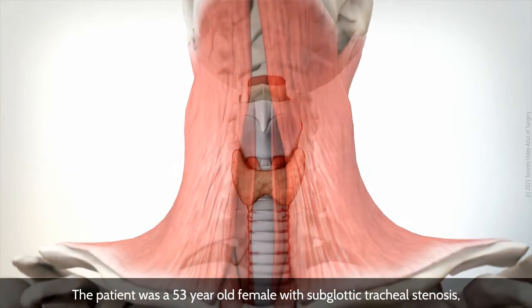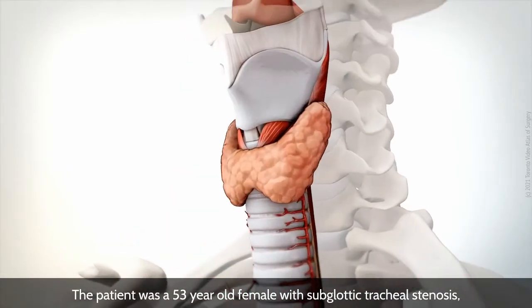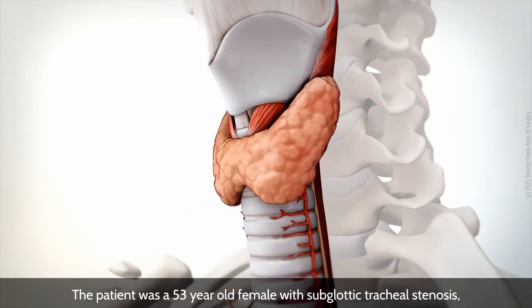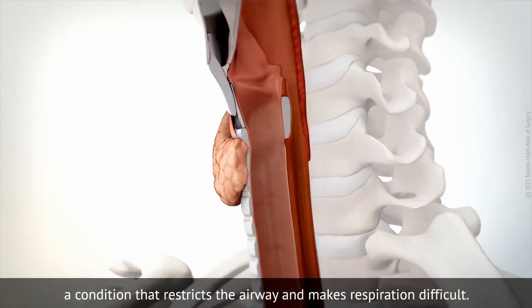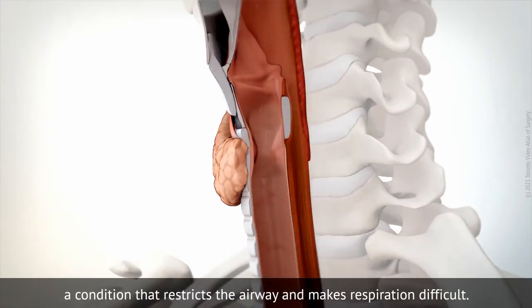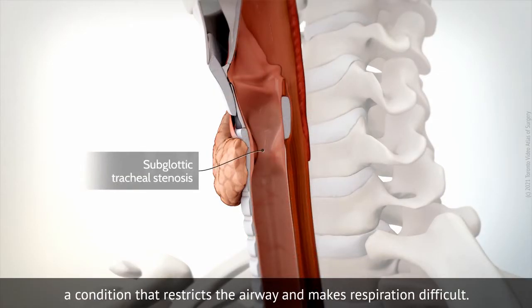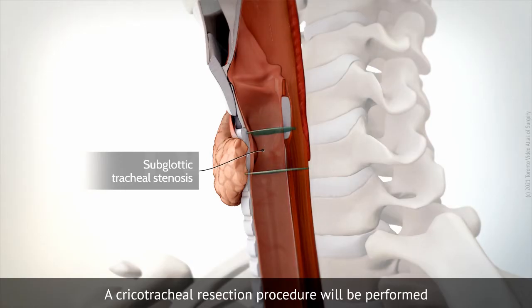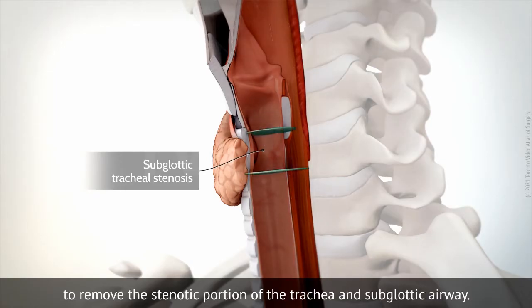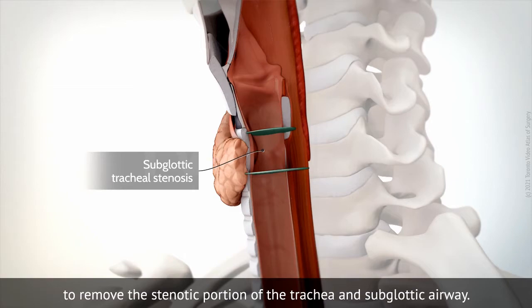The patient was a 53-year-old female with subglottic tracheal stenosis, a condition that restricts the airway and makes respiration difficult. A cricotracheal resection procedure will be performed to remove the stenotic portion of the trachea and subglottic airway.